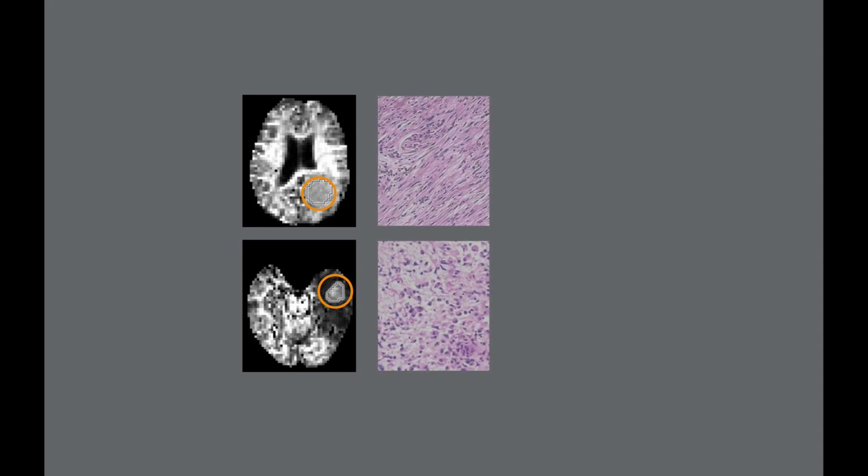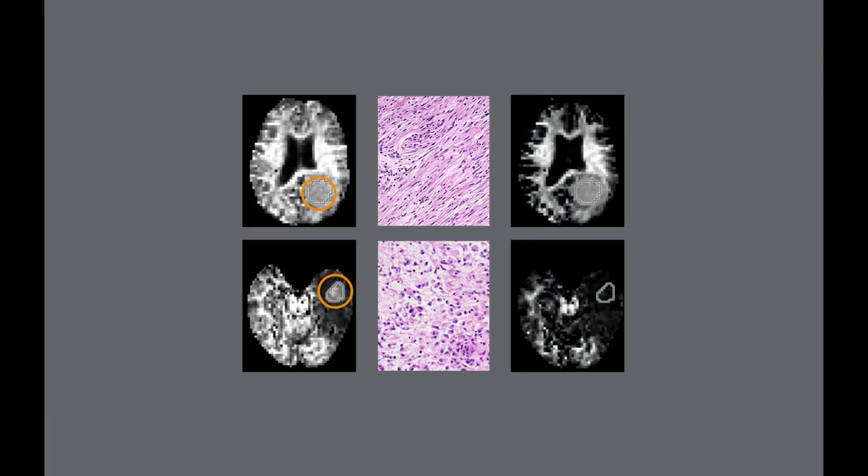This figure, showing two different brain tumors as published in Neuroimage by Dr. Stepankiewicz et al., clearly displays the increase in specificity achieved with MDD. Relying on conventional methods, the two tumors, although featuring distinct cell densities, shapes, and orientations, look similar on the conventional scan. Using MDD, the isolation of information imprinted by the tissue microstructure allows for tumor separation.